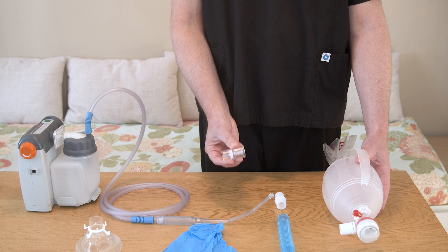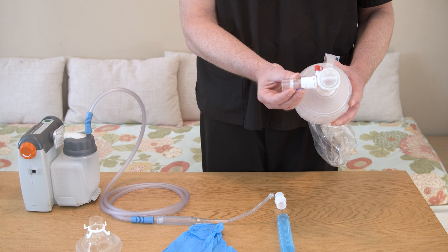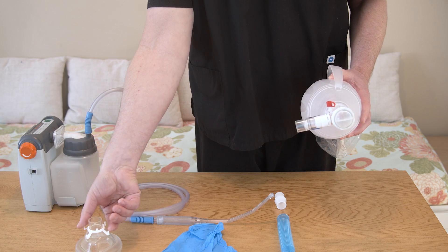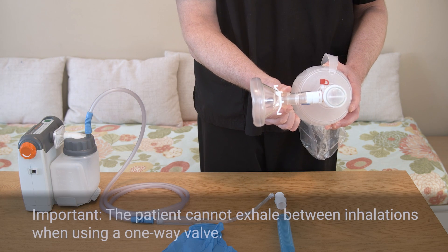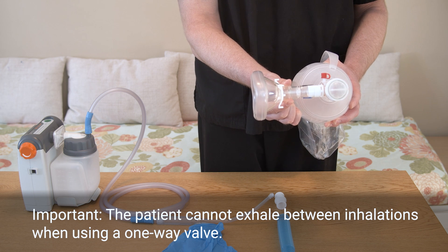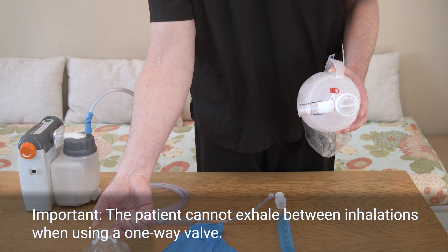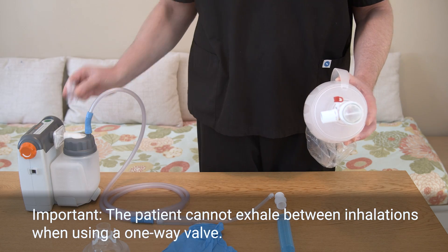If your health care provider orders a one-way valve, you can add it to the resuscitation bag. While adding a one-way valve may make breath stacking more effective, the patient cannot exhale between inhalations. This can be uncomfortable and cause lung damage. For safety, in this home care video, we will not use a one-way valve.